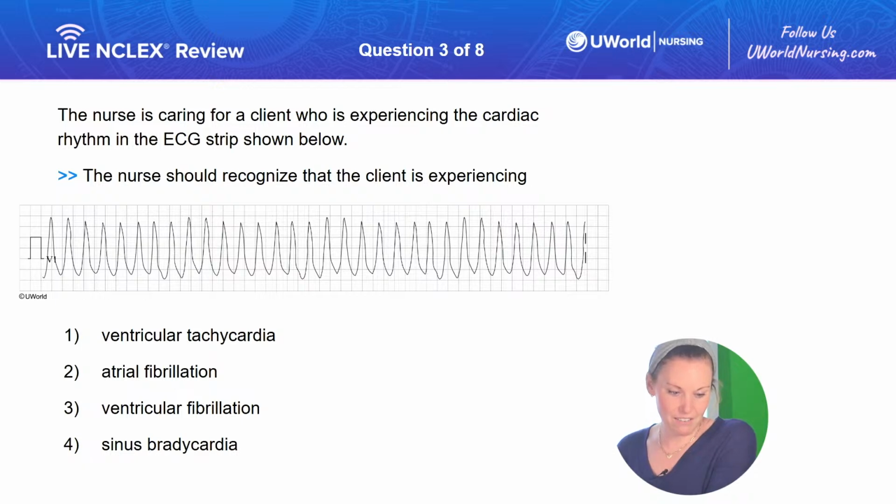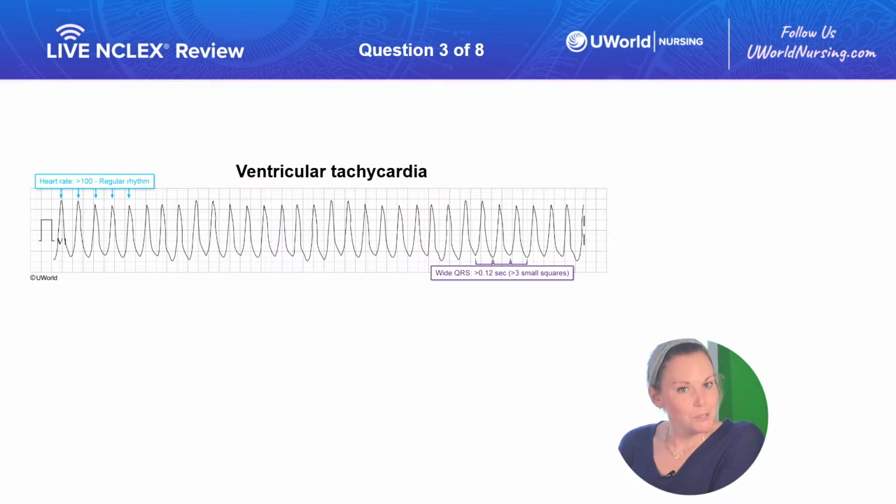All right, good work, you guys. Okay. Our correct answer on this one is going to be option 1, ventricular tachycardia.